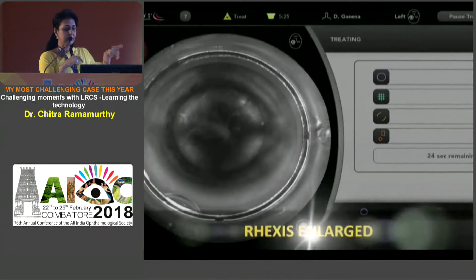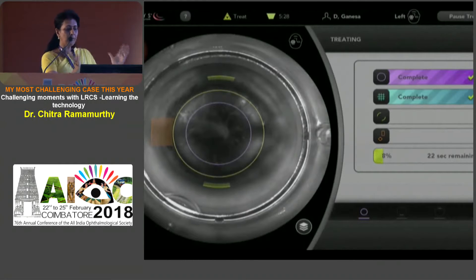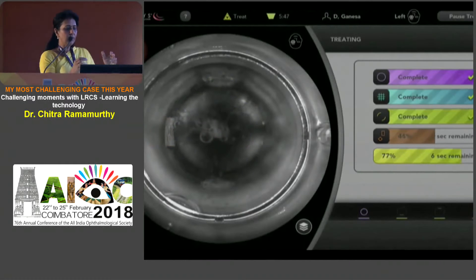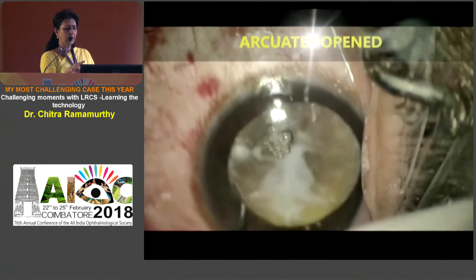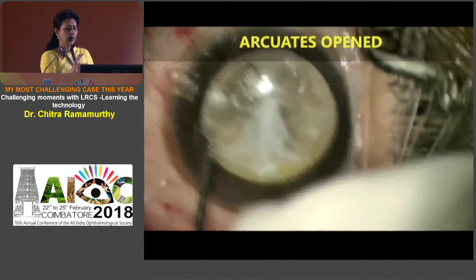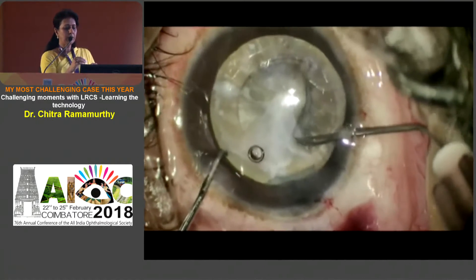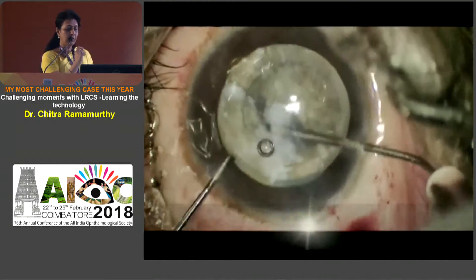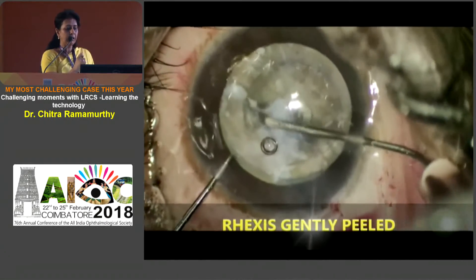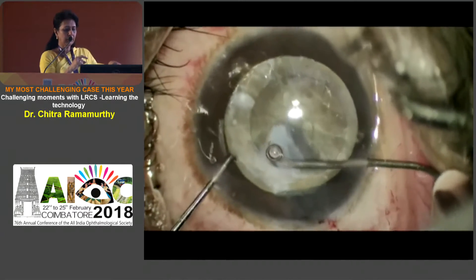You could see it was very dense fibrosis of a traumatic cataract. So I expand the area of the rhexis so that it's well beyond the fibrous ring. The patient was a young guy and the cataract looked quite hard, though traumatic cataracts are largely soft cataracts. I have made arcuate incisions also to correct the astigmatism. Normally I would not stain, but this was a situation where I needed to know whether the rhexis was cut because of the fibrous ring. Thankfully, nearly three-fourths of the circumference has been cut.